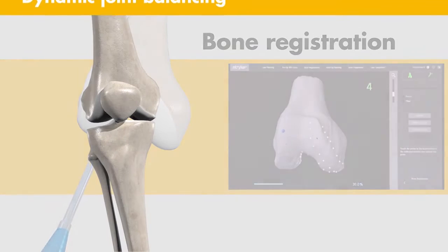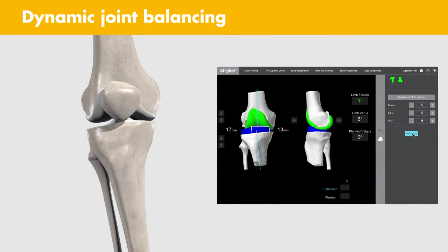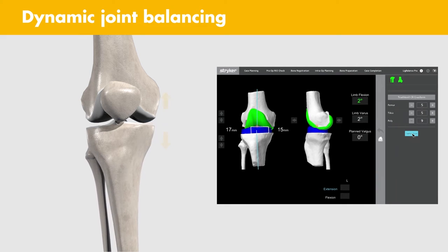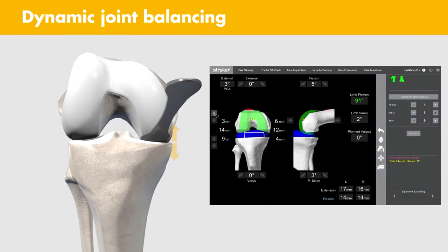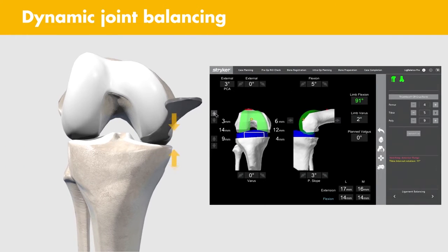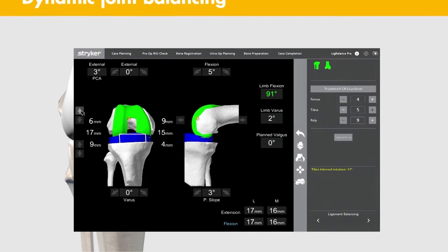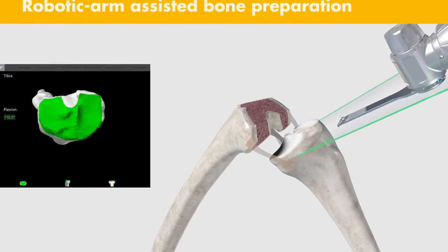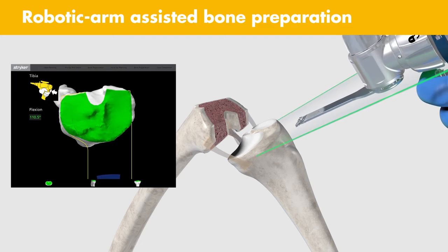With dynamic joint balancing, Mako provides you the flexibility to modify the pre-op plan after completing a kinematic assessment of the joint. You can perform intraoperative adjustments to optimize implant placement.